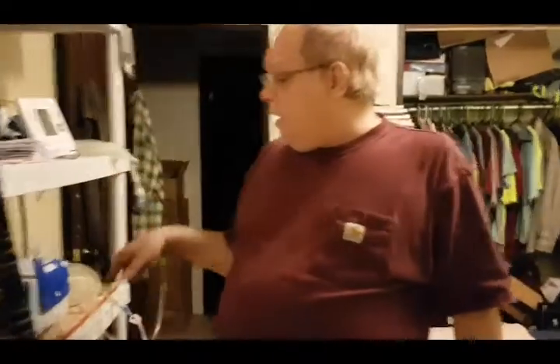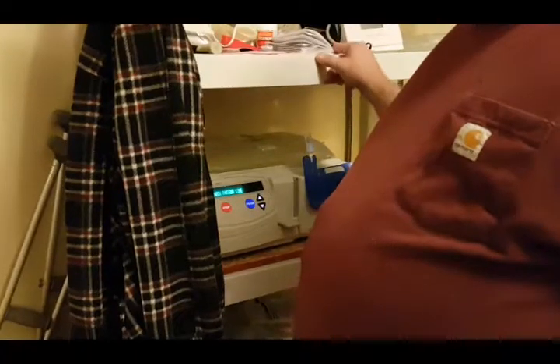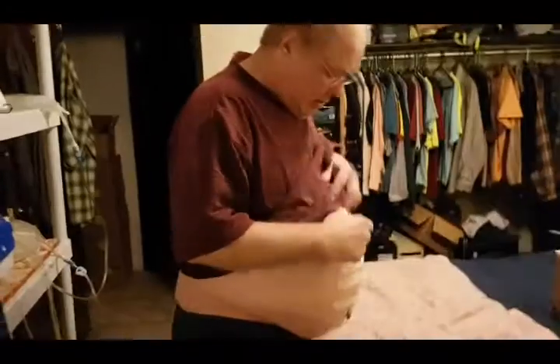Now in the morning, I got 4 data sets that I need to record from here, and I log them in the book. And that pretty much covers the machine until I hook up, which I probably won't go into all that, but it's just pretty simple. Hook it to here, and that's about it. So over there on top of the bed, this is NetPro.